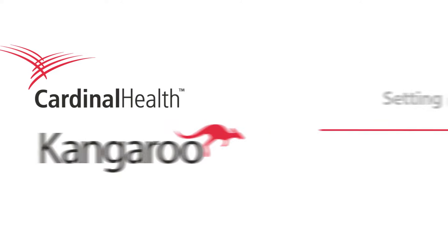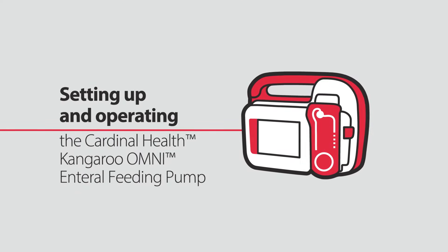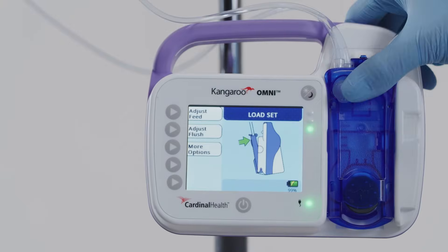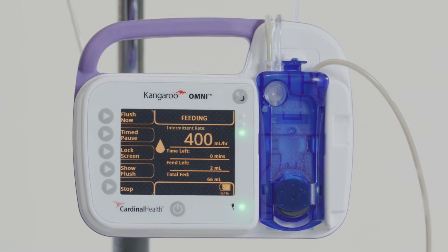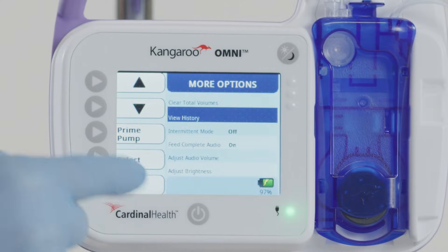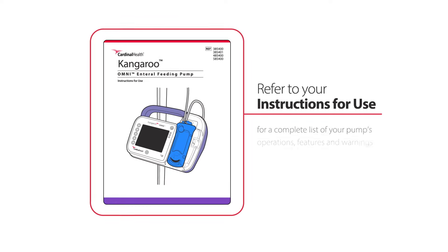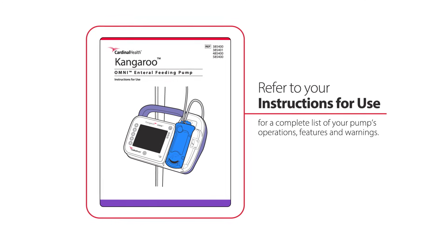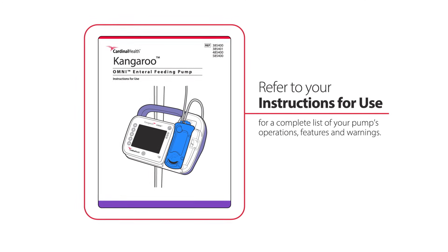This video will walk you through setting up and operating the Kangaroo Omni enteral feeding pump, including loading a feeding set, turning on night mode, reviewing feeding history, and more. Please refer to your Kangaroo Omni enteral feeding pump instructions for use for a complete list of your pump's operations, features, and warnings.